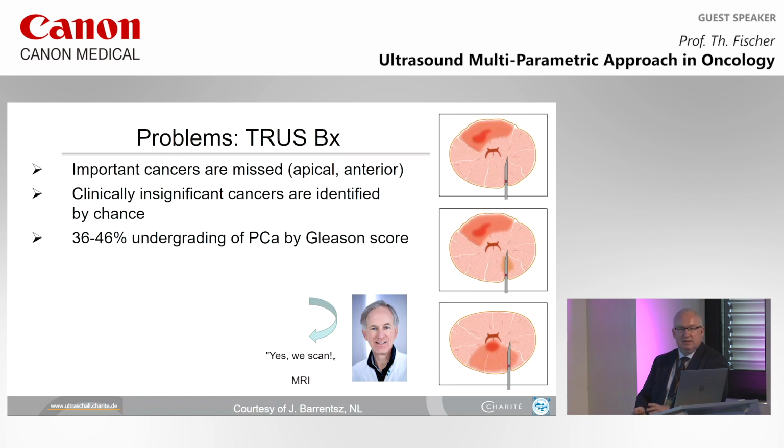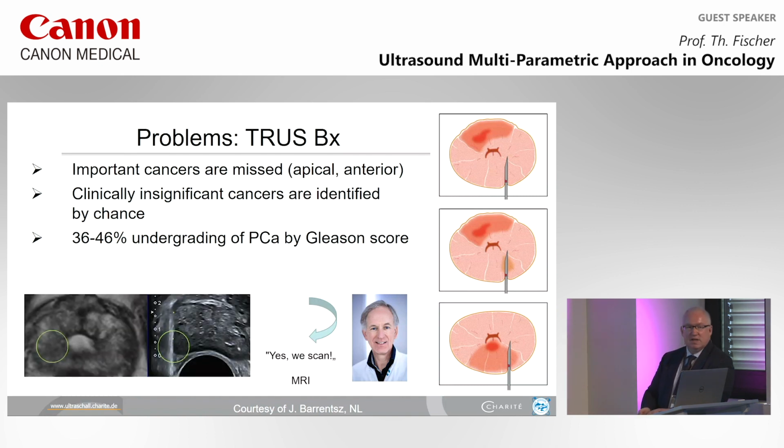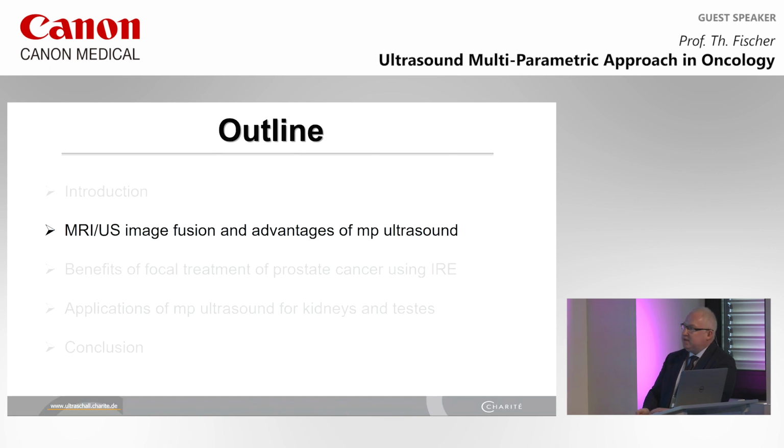And that's why this guy from the Netherlands told us we have to scan each patient in MR. That's good news for all radiologists, because now the patients get in touch more and more with MR evaluation for the detection. But then, of course, we have to use ultrasound to make a target biopsy, which is absolutely important. And now we have the right stuff to do this. MR ultrasound image fusion is the key feature to handle this problem.